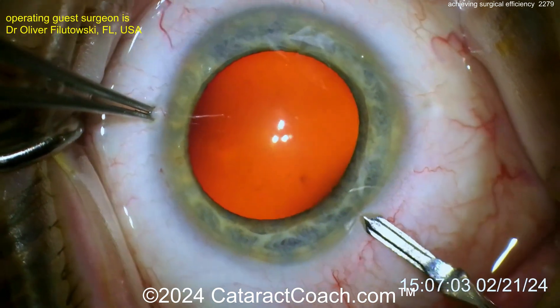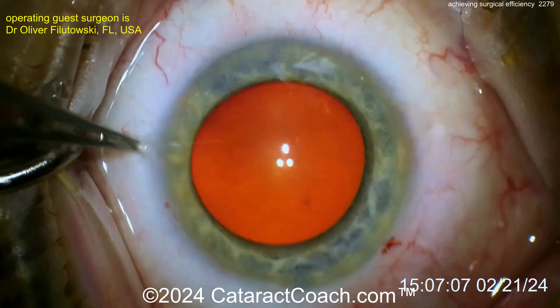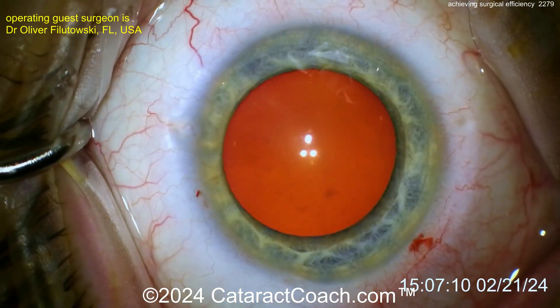Now holding on to the eye, here comes a second paracentesis incision, there you go. And even a third. So we've got three paracentesis incisions here.